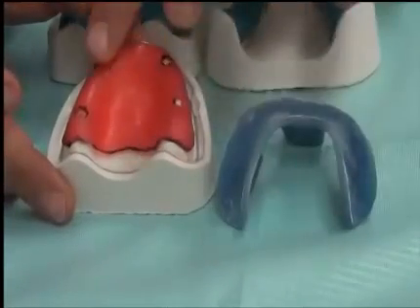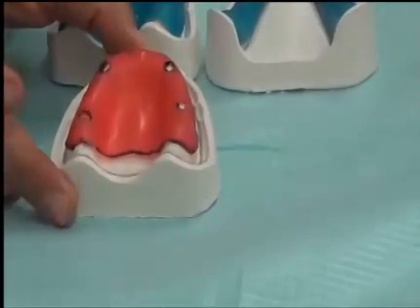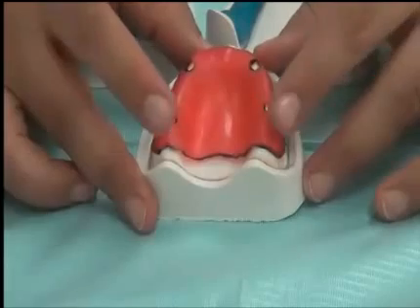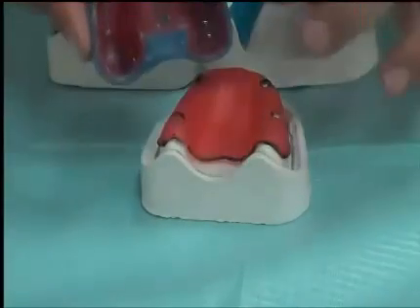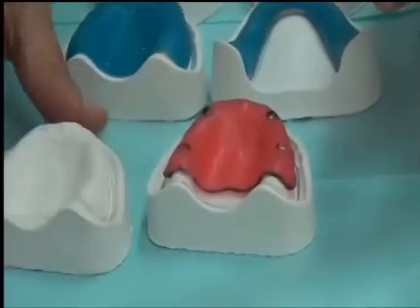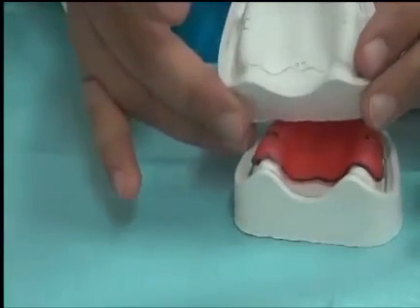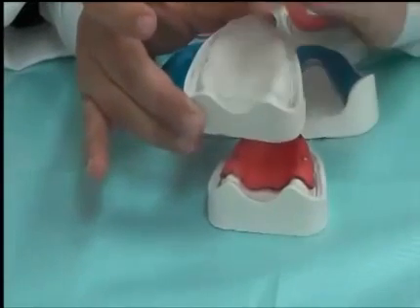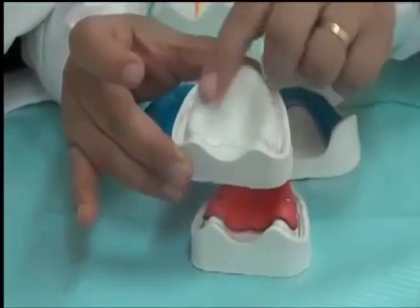But in the cases where we take an impression with a full relief, we will have that the denture, while functioning, will be put on the tissue while in resting position. So, all of the areas covered in wax, once we take out the wax and begin the impression procedure, these areas will all be taken as static. Nothing is compressed or recorded in a compressed status. Once we place the denture and fabricate the denture over resting tissue, the denture as a solid material and under occlusal function will not stay solid, and it will not stay in place.